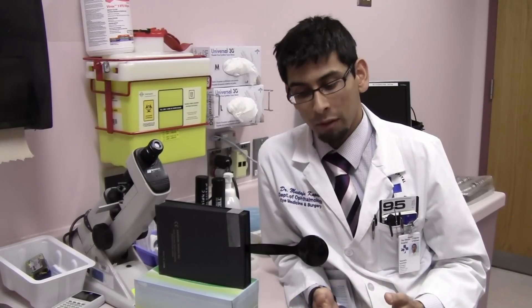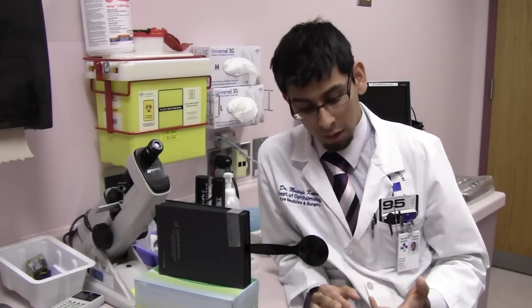Hello everyone, my name is Dr. Capacci. I'm going to talk to you about how to assess for strabismus, for phorias, for tropias. We're going to talk about the cover-uncover test and the alternate cover test.